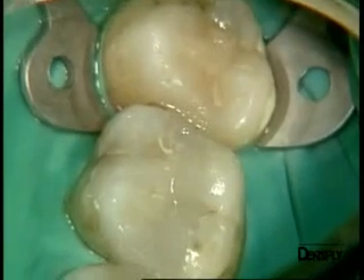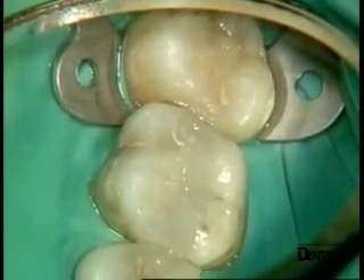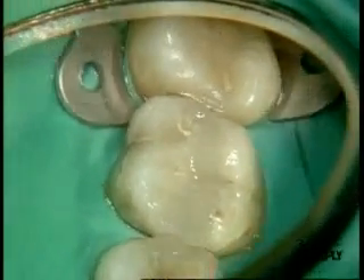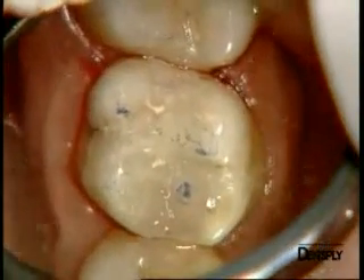Cosmetically, they show a good integration and adaptation to the surrounding teeth. This is especially true of tooth six, due to the presence of the opaque shade of X-Flow that has masked the unsightly discoloration caused by the amalgam.